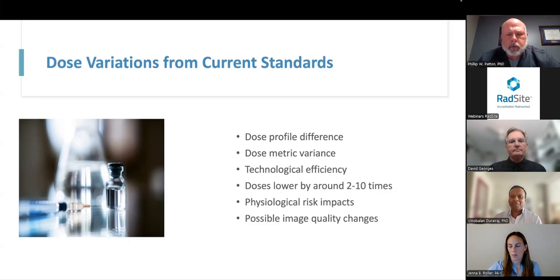Yeah, so the effects that we're concerned with, they have the same source. They're an X-ray generated source. And so we are looking at the same type of impact. So the radiation coming in from typical photon causing the changes. But you're right, it's well above the diagnostic range. We've been using conventional CT for quite a long time, multiple conventional CT scans, and the CBCT with a lower dose will even have less of any effects. But we're not really concerned with the majority of the CT scans until we get to a large number, because as you stated, the actual concerns are higher than the diagnostic range of exposure.